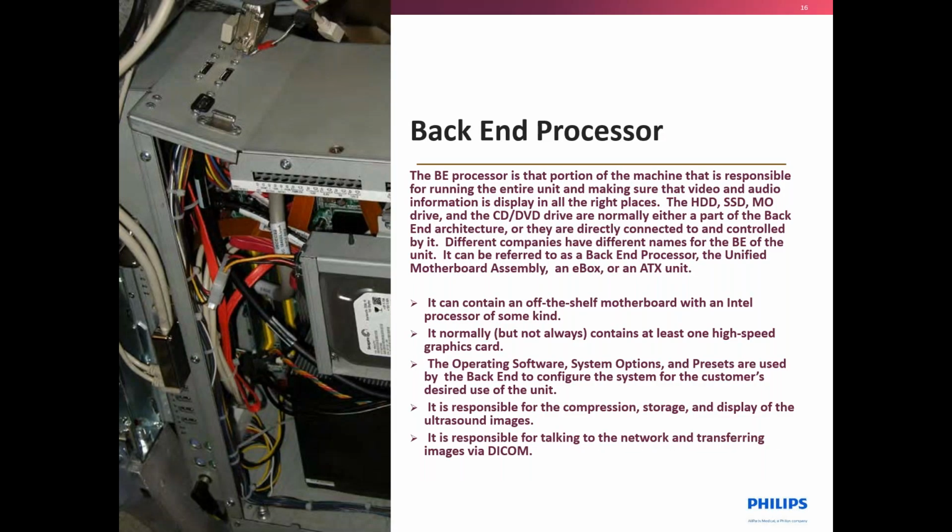Let's move to talking about the back end of the ultrasound machine. The back end processor is that portion of the machine that is responsible for running the entire unit and making sure that the video and audio information is displayed in all the right places. The hard drive, SSD, the MO drive, and the CD/DVD drive are normally either a part of the back-end architecture or they are directly connected to and controlled by it.